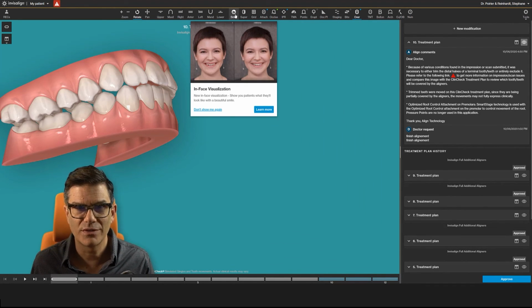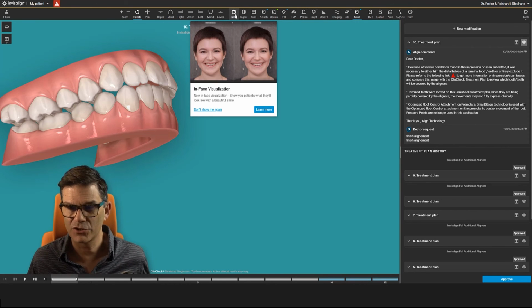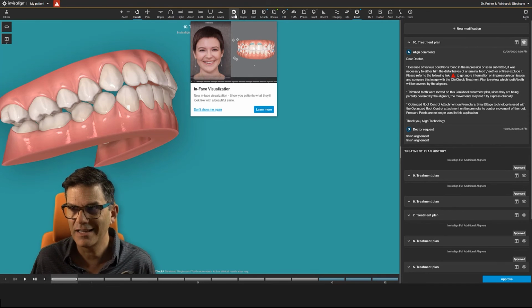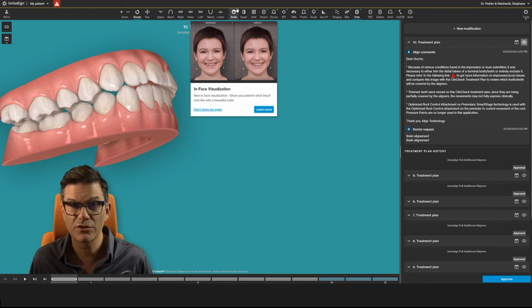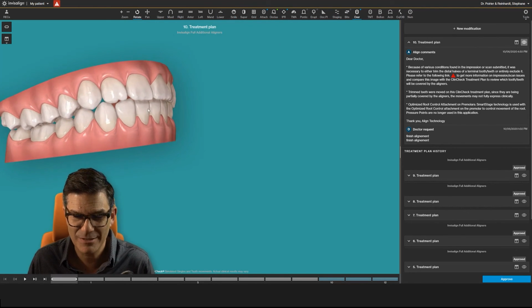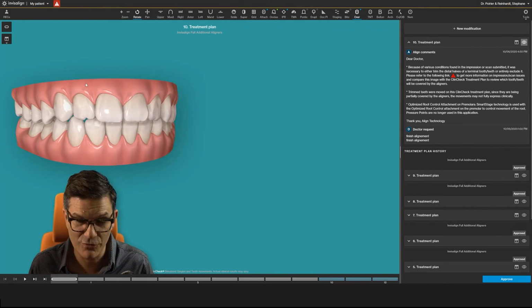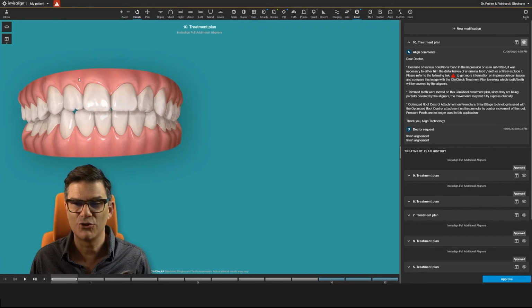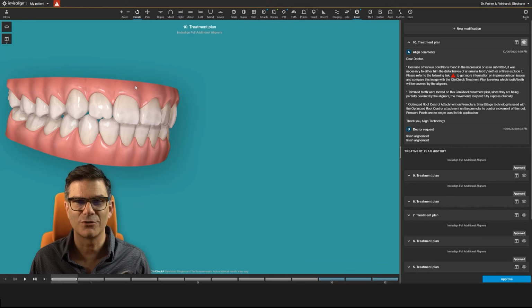I started with Align to use Invisalign in 2004, and it's incredible when I look at everything that changed over time. I treat patients today that I said 10 years ago I could never treat. And I treat them today because, yes, I have more knowledge, but because of all the improvements, they put so much money in research and development that this is such a big improvement. I mean, you have to use it. You have to have fun with it, do cases, and don't be afraid to talk about it to your patients.